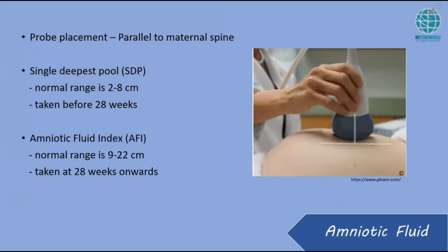Let's look at the amniotic fluid. The only way to do it is to place the probe parallel to the maternal spine. Don't put it loose — it has to be straight. We can't really do it at 90 degrees, but as straight as possible, parallel to the maternal spine.